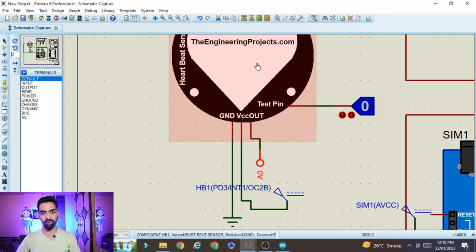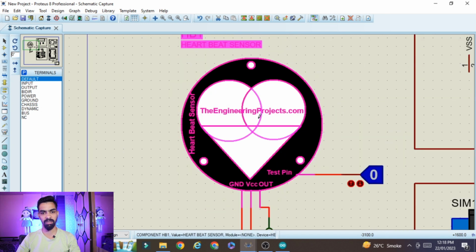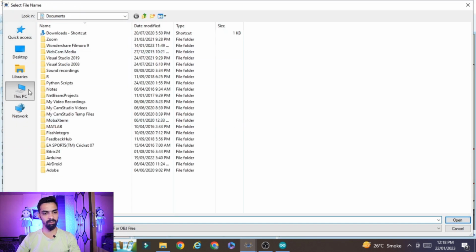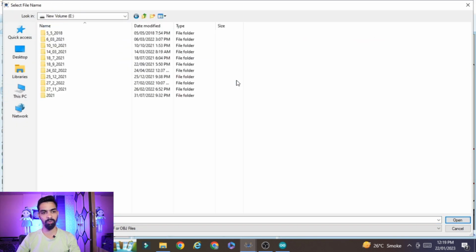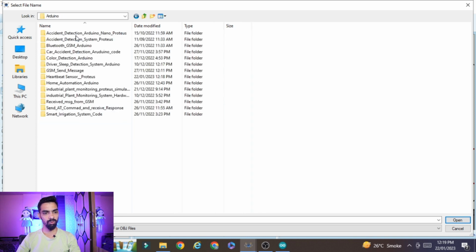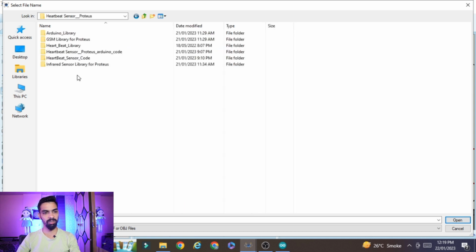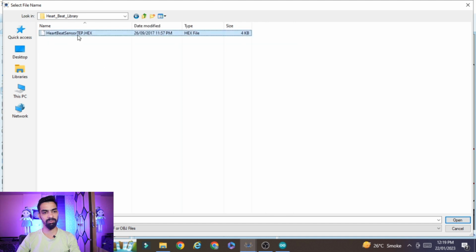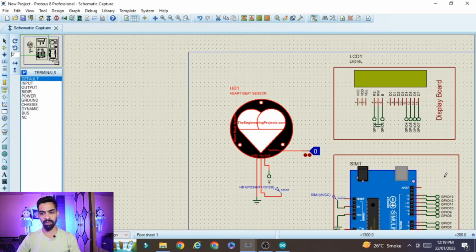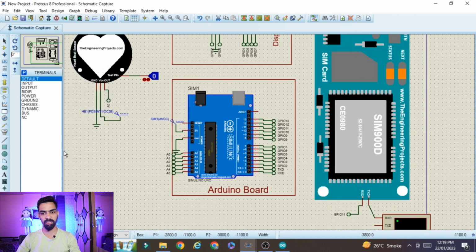Then double click on this heartbeat sensor and go to the program files. Then go to the downloaded folder again from my Google Drive link. So this is the downloaded folder, heartbeat sensor, this one, and after that you will find the heartbeat sensor library, and inside that you will find the hex file. You have to load this hex file into this sensor and then click on OK. Then your project is completed.